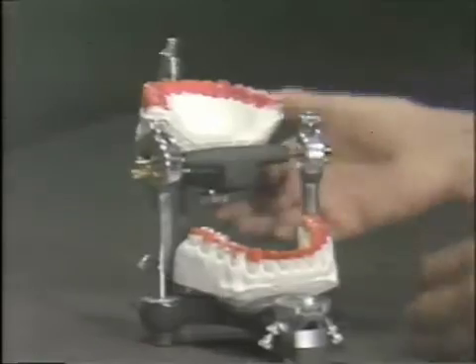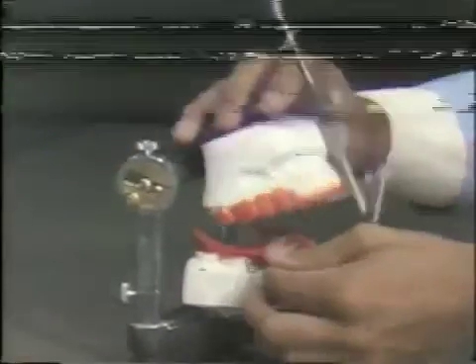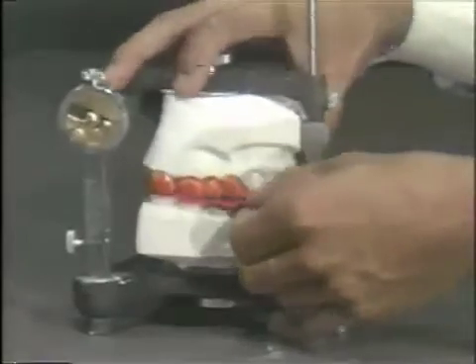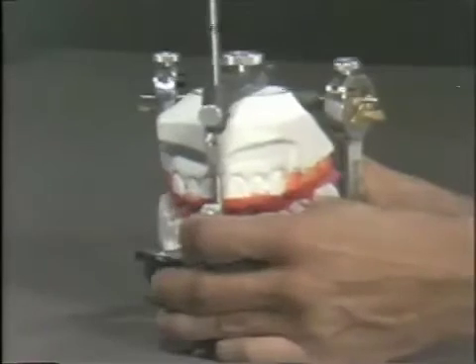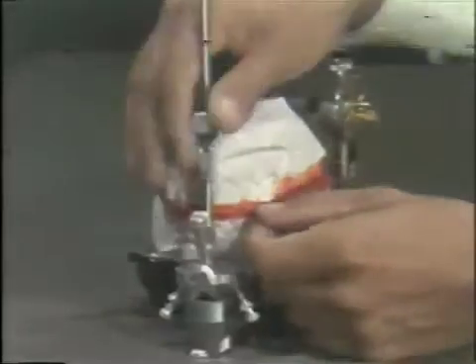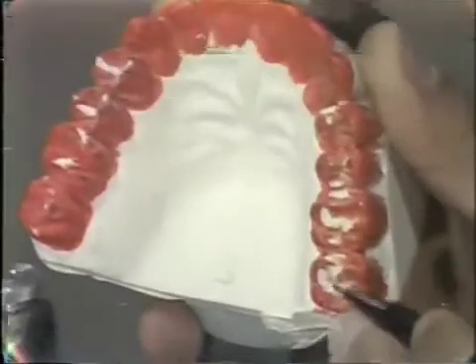We will again take the area and mark it, putting the ribbon in on the right-hand side, going into the working excursion, and then putting it on the left-hand side, repeating the working excursion, because we want to duplicate the balance on this side. Now I'm starting to get a feeling that it is much more smooth than it was before. Going back and checking the maxillary areas, we see that up here we have a slight increase — there's a contact right here in this particular area.